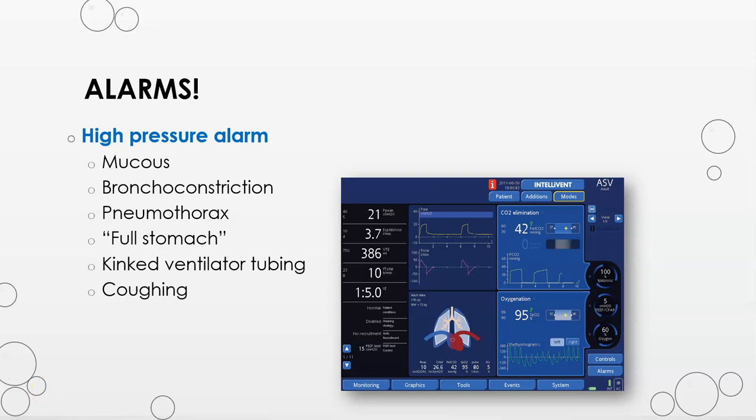The alarm will sound. Does the patient need to be suctioned or is there a mucus plug? The patient on mechanical ventilation usually has an NG tube in place. Does the tube feed need to be irrigated? If the patient is receiving enteral feedings, is there a large residual? A full stomach will push up against the diaphragm and increase intrathoracic pressure. Is the patient coughing and what we call bucking the ventilator, as there is counterpressure? Are there any kinks in the tubing?